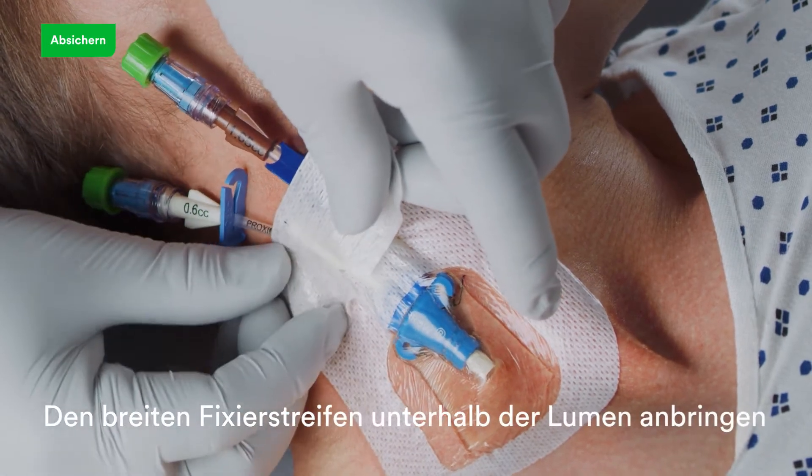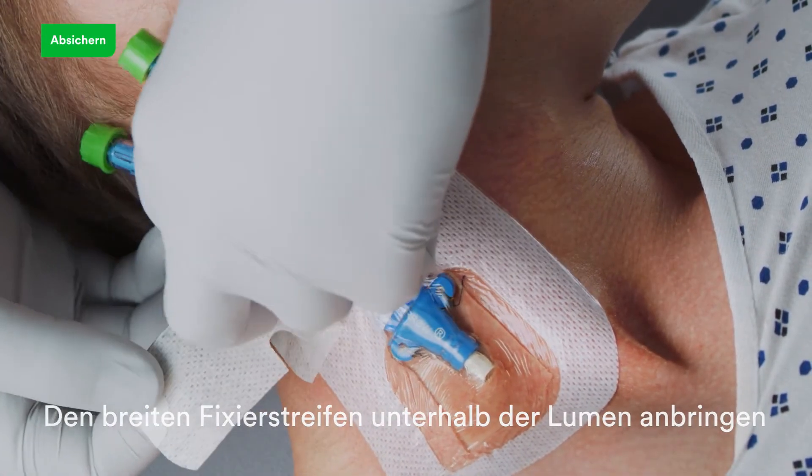Apply firm pressure to the securement border with one hand while removing the border frame with the opposite hand. Apply the securement tape strip under the device tubing and overlap back onto the dressing.